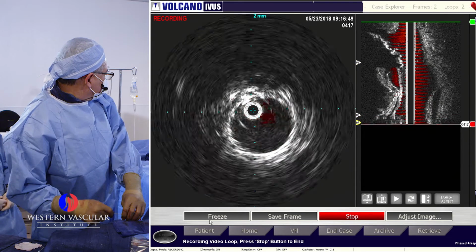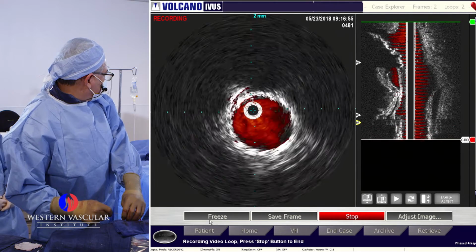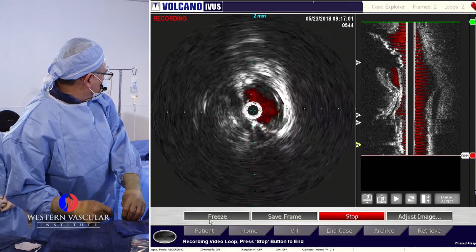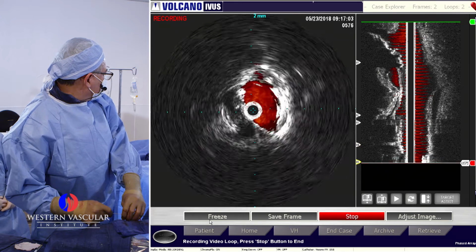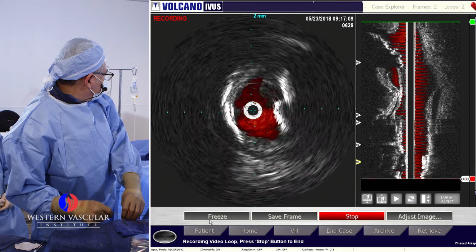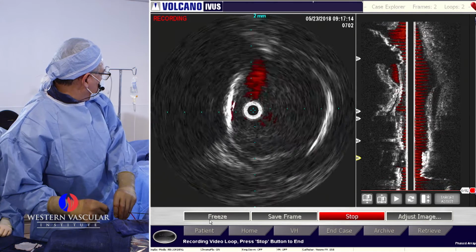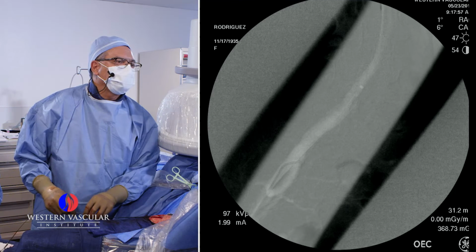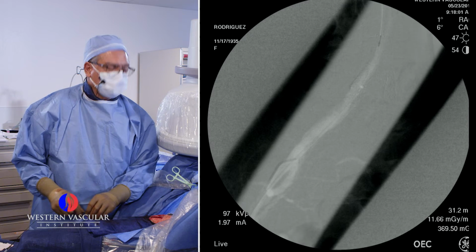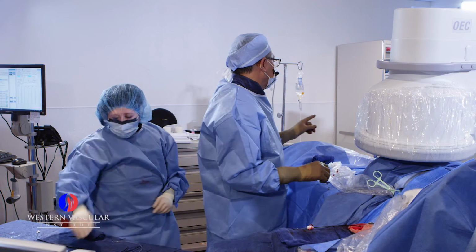So that's the stent. You see how it stands out by the shining circumference of the metal. The stent itself actually doesn't look bad this time, but again, this is this collapse area. And that's the aorta right there. All right, so let me see where the probe is, right at the top, no? Very good. So let's go back to that two-dimensional view and get some measurements.